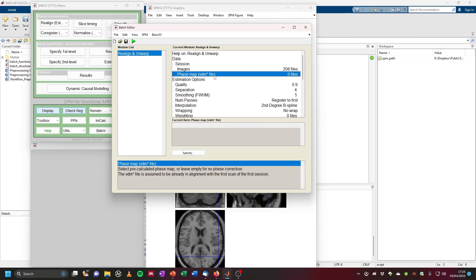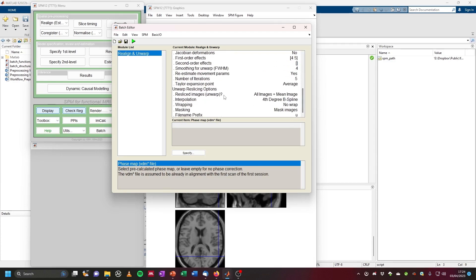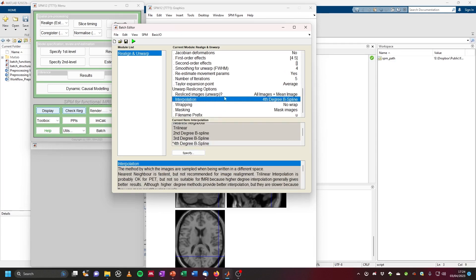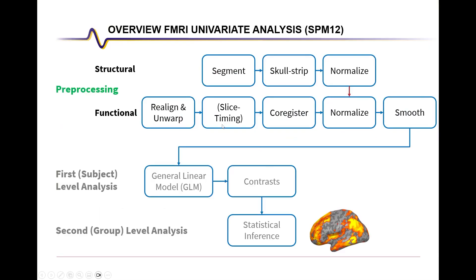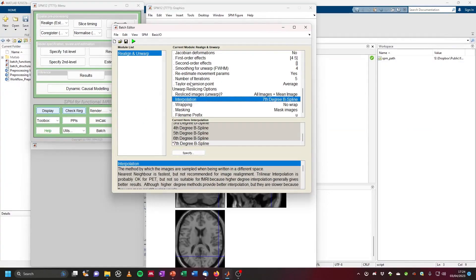We have the option to put in a field map here, which is created from a field map scan. Not all fMRI studies acquire field maps, and this one didn't, so we will leave this empty. Unwarp can also be performed without a field map by using the realignment information. The defaults otherwise are fine — the only thing I like to change is under the 'Unwarp Reslicing Options' to select 'Seventh Degree B-Spline' to allow for maximum interpolation.